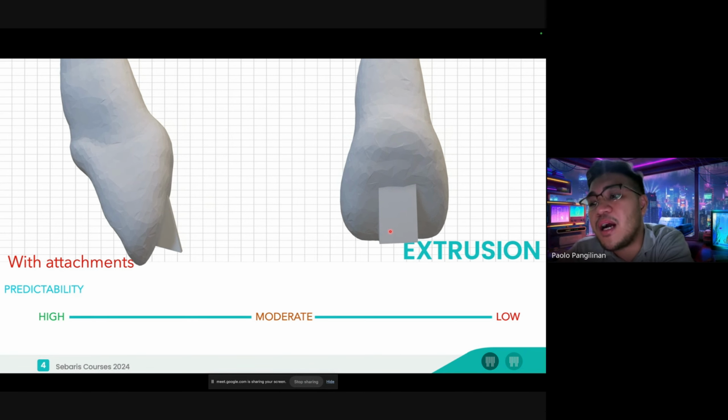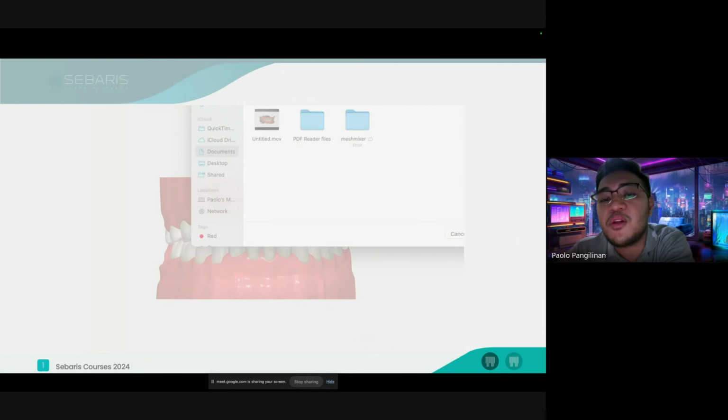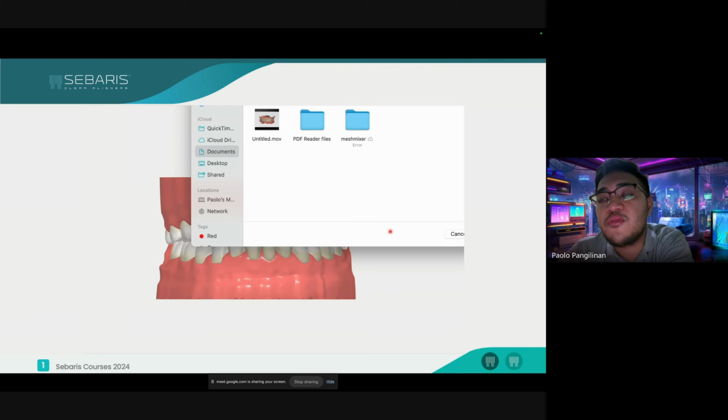If you combine a low-predictability movement with a more predictable movement, you're technically getting a net result. So in terms of staging, we combine all of those things. That's principle number 2, combining movements. We can do multiple movements.